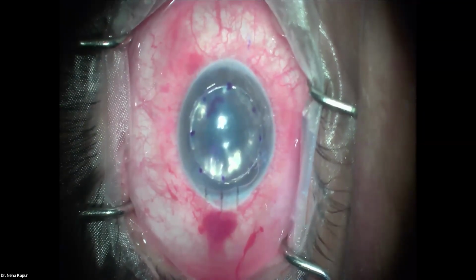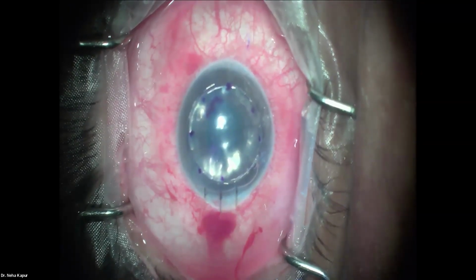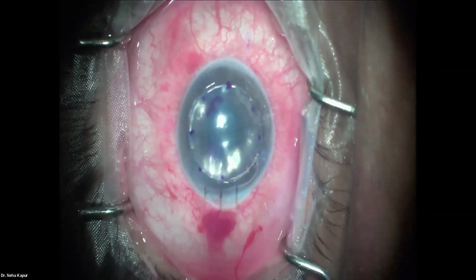The next question is, when are the sutures removed? Usually after about 6 weeks, we can take off these sutures.